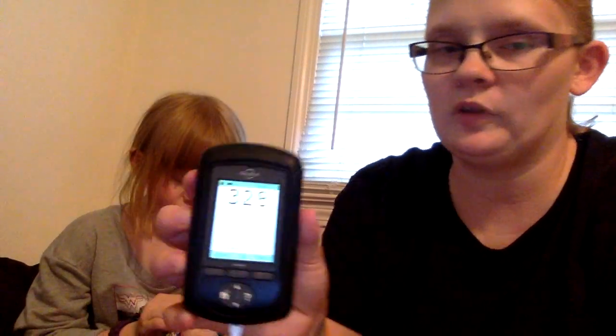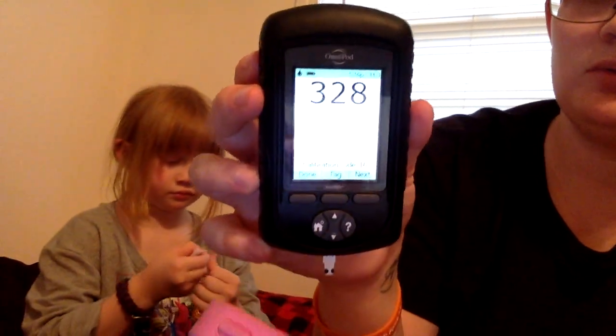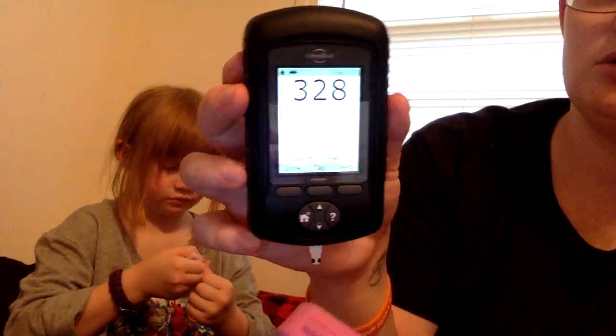So, again, you test, you hit light. Okay. Just do it. And you just test it right on the side again. Quit licking your fingers, you weirdo. Okay, so 328, which is really close to the other one, so that's good.